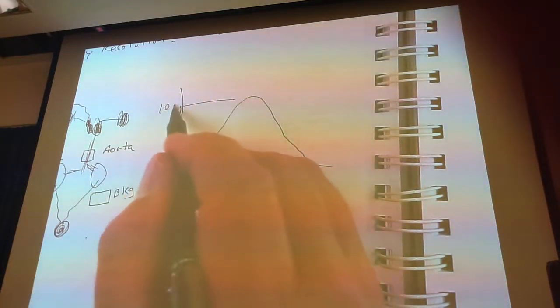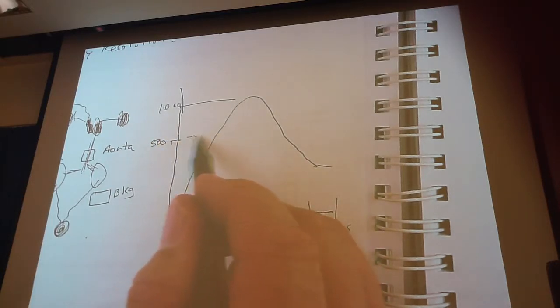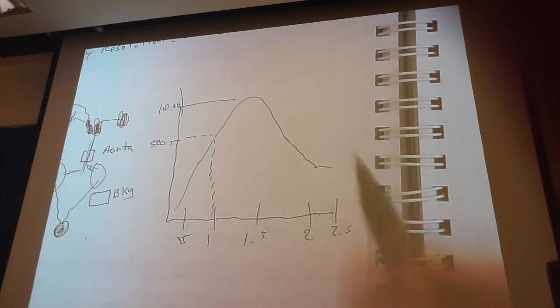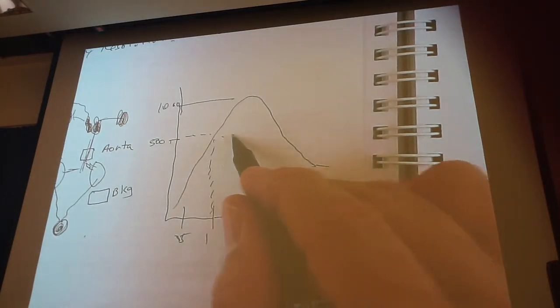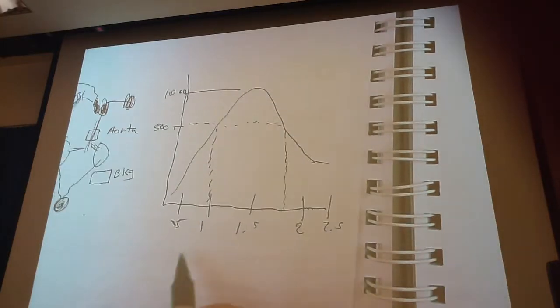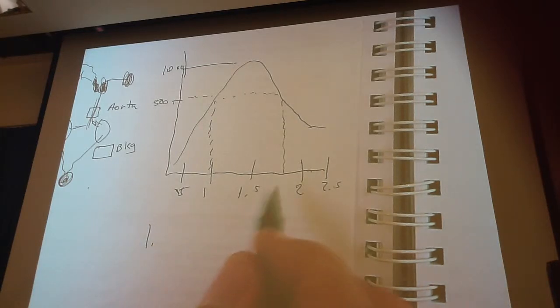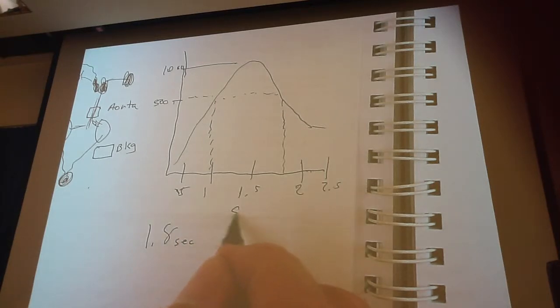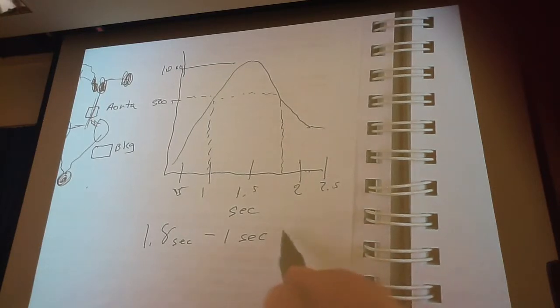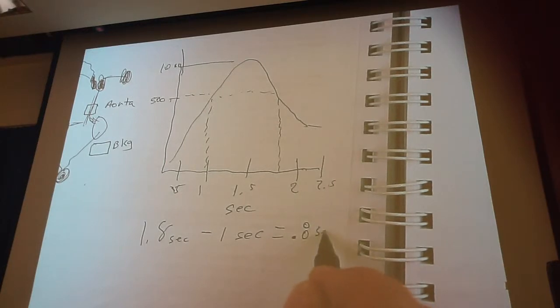Let's say there's 1,000 counts here. So you go down to 500 counts, and you find the corresponding time for that. Okay, so basically we have like 1.8 seconds here, because this is my time, minus 1 second. So my bolus is actually a duration of 0.8 seconds.